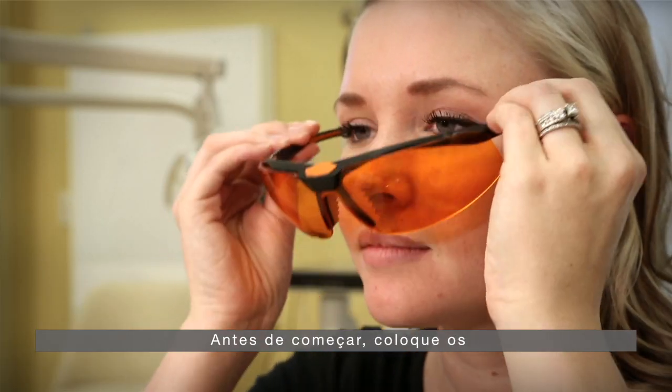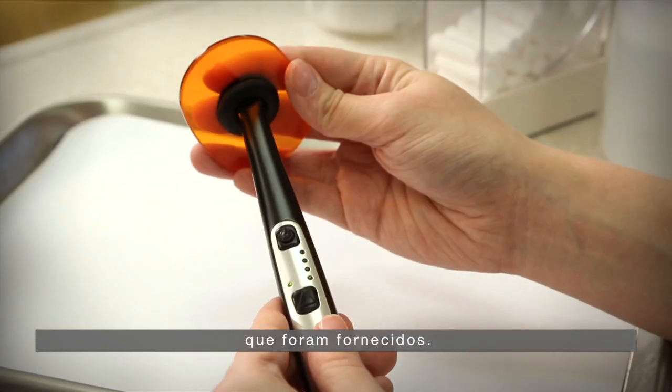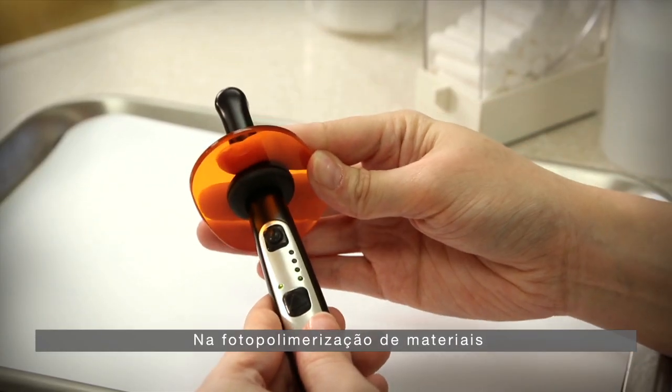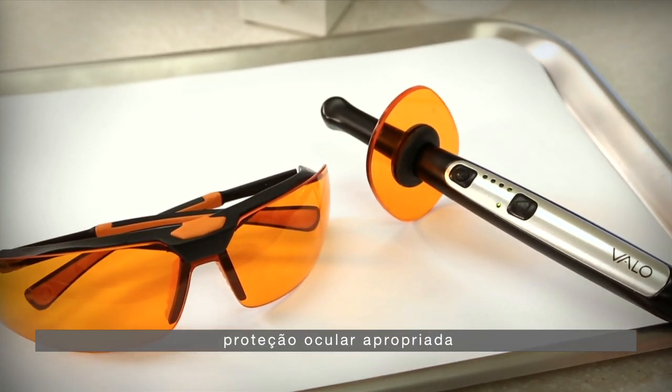Before you begin, please find the orange safety glasses or light shield that have been provided. When light polymerizing any dental material, we always recommend the use of appropriate eye protection.